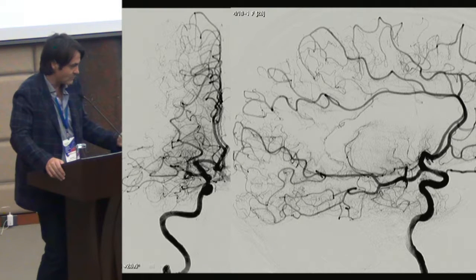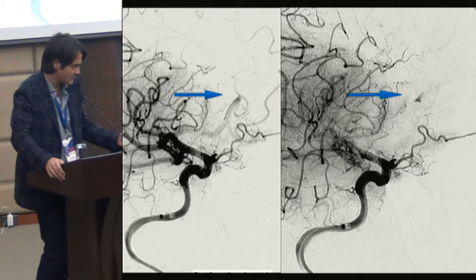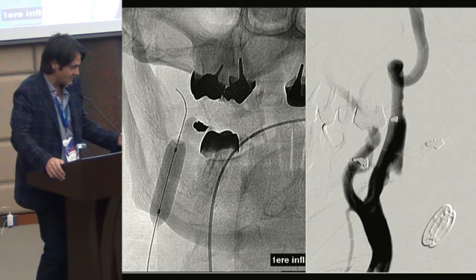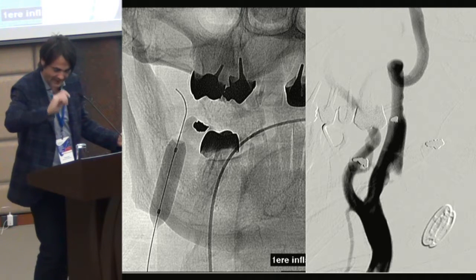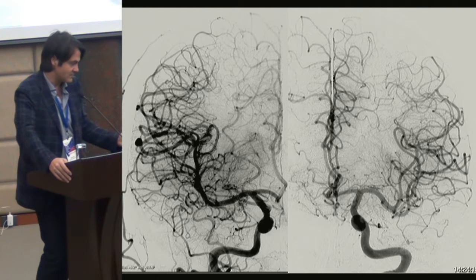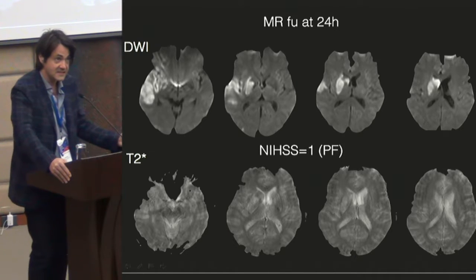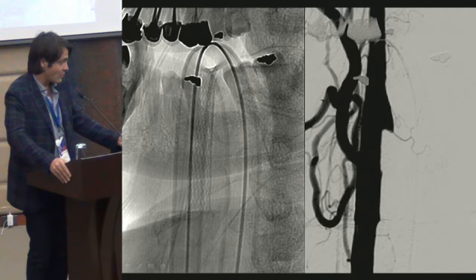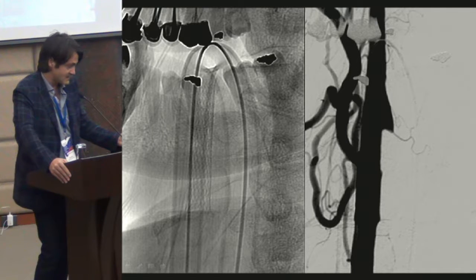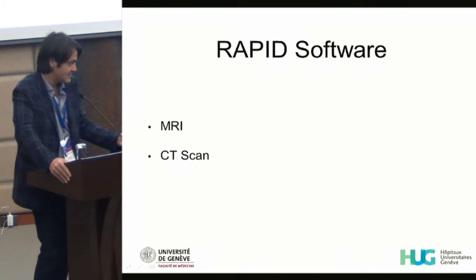So we passed through the proximal occlusion with an intermediate catheter, and we recanalized the intracranial, and then to get the opening of the carotid, we did angioplasty with complete reperfusion of the intracranial level. This is the control made after the treatment, with essentially the same extent of the ischemic core, and then we finally treated by stenting the carotid of the patient 2 weeks later.